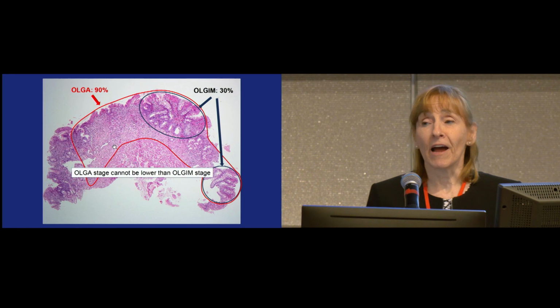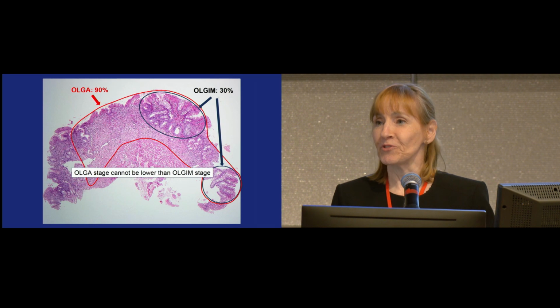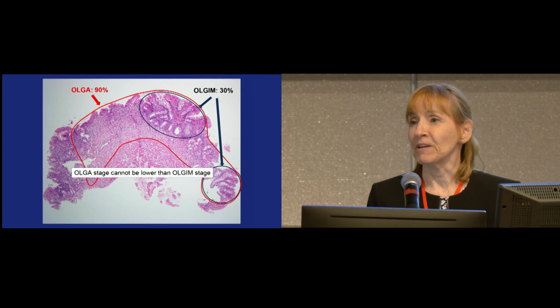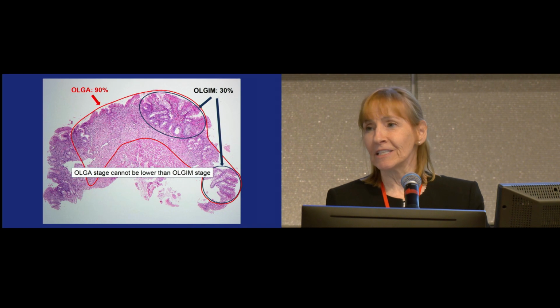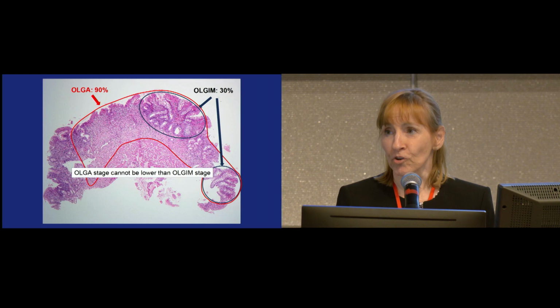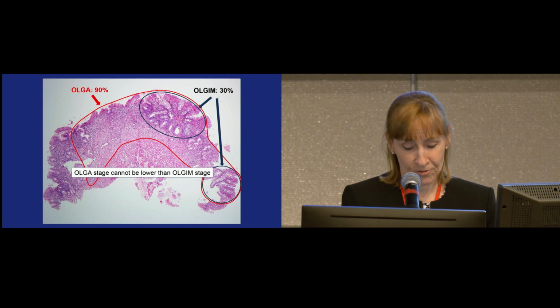And I have emphasized this several times, but you see lots of published papers when they do OLGA separately, OLGIM, and then you realize that OLGA is lower, and that's not possible. So if it's done that way, this doesn't work.